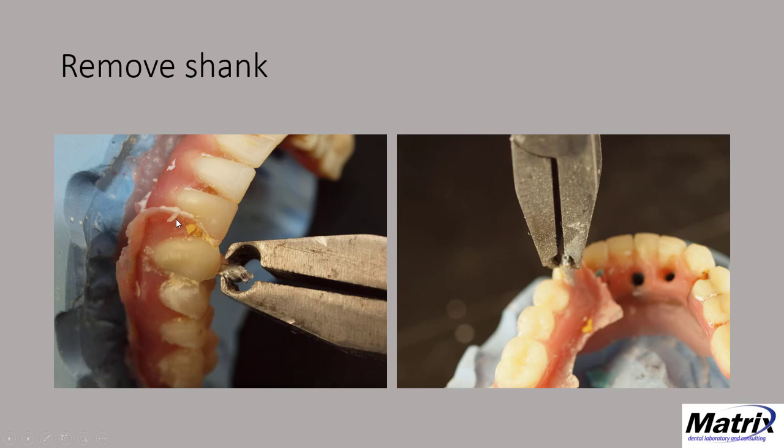The cool thing is, remember that this isn't really adhering here. I have a separator on there, and it doesn't really bond to the tooth. If it does, you just take a little chisel, and I just wedge it underneath, and it pops right off.